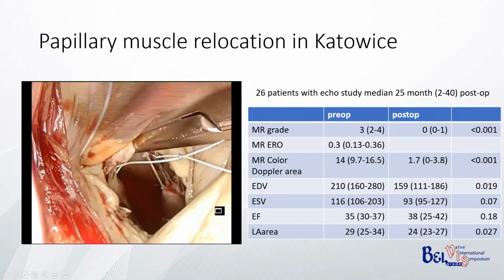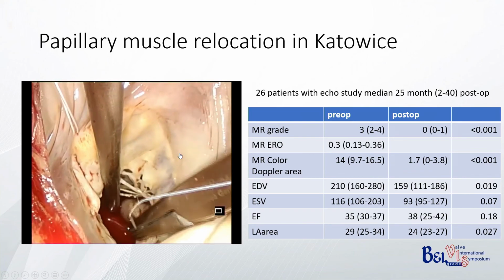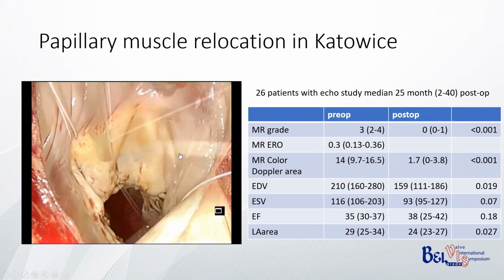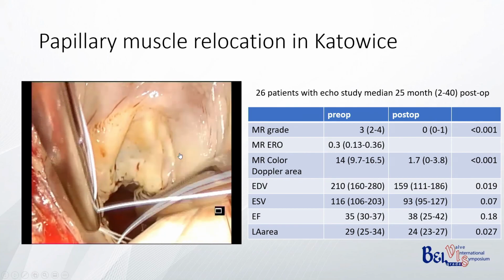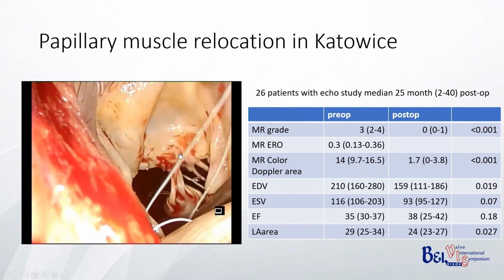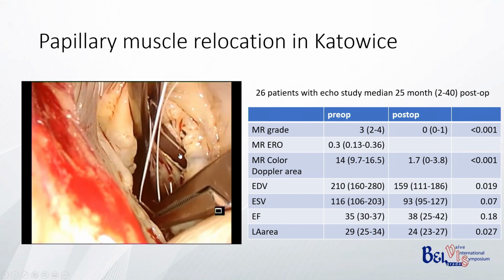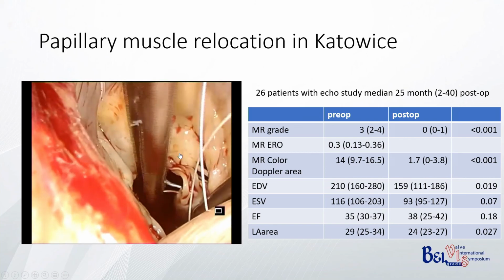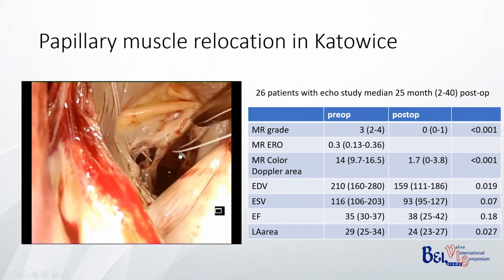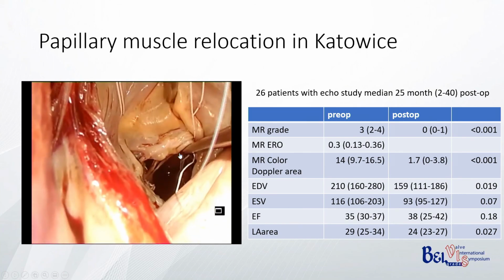This is the anterolateral one, and then you bring them through the anterior annulus near the fibrous trigone. This is the posterior papillary muscle with this posterior head, which is reattached to the anterior head to bring those both together. And then again, the anchoring PTFE, this is CV4 stitch, is exteriorized here into the atrium via the anterior annulus near the trigone.